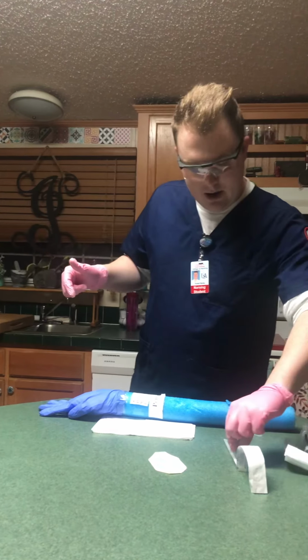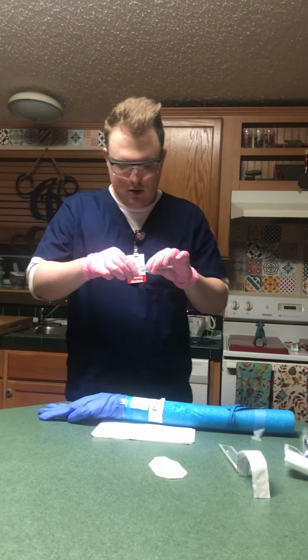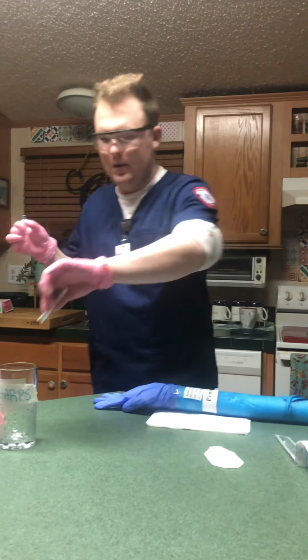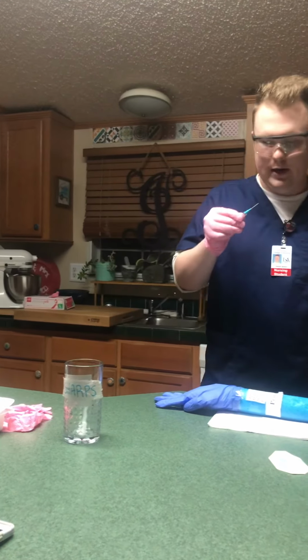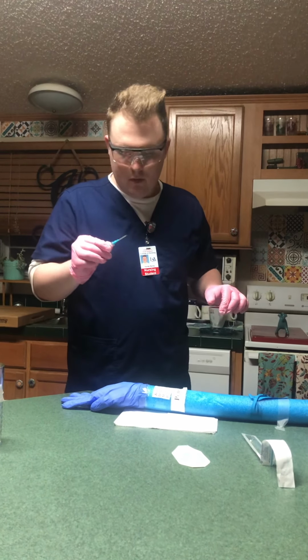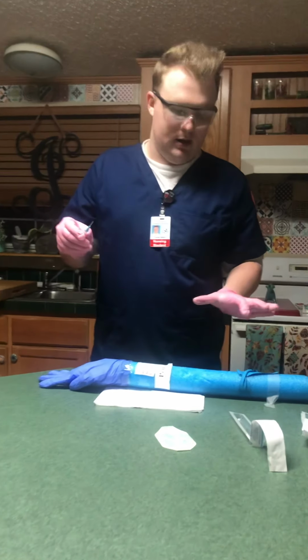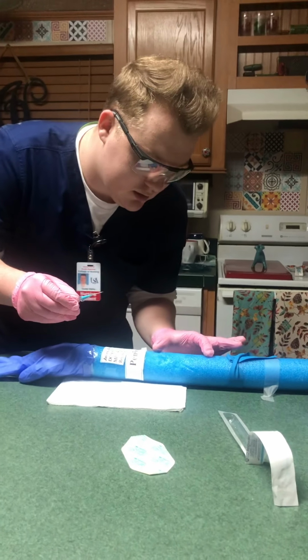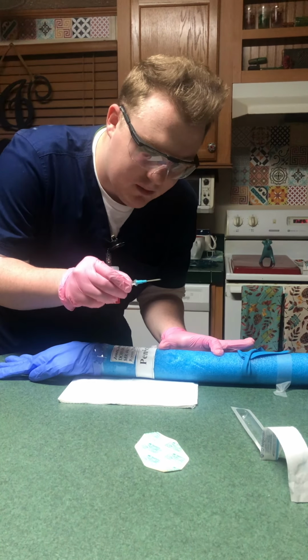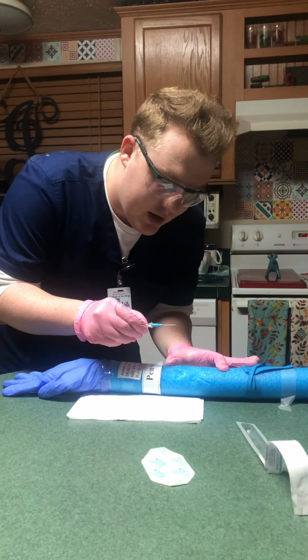So I'm going to get my over-the-needle catheter. And I'm going to remove the cap, dispose of this in the sharps, and I'm going to have it placed bevel up. And now, without touching the exact vein, I'm going to spread and hold traction. And I'm not going to let the hub of the catheter touch my thumb. And I'm going to insert at a 10 to 30 degree angle, bevel up.